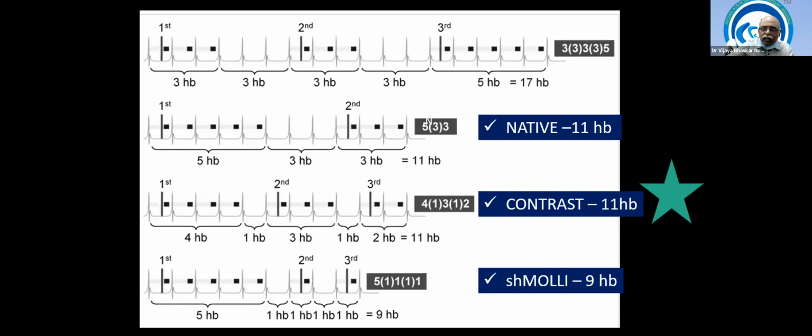So this is the influence of the magnetic field created by the gadolinium compound in the myocardium. T1 relaxivity is faster, which means the recovery is faster. When the recovery is faster, there is no need for you to wait for 11 or 12 seconds. You can give a pulse, require 4 beats, 1 gap, then again take 3, one heartbeat gap, again 2, because the T1 relaxivity is made faster.